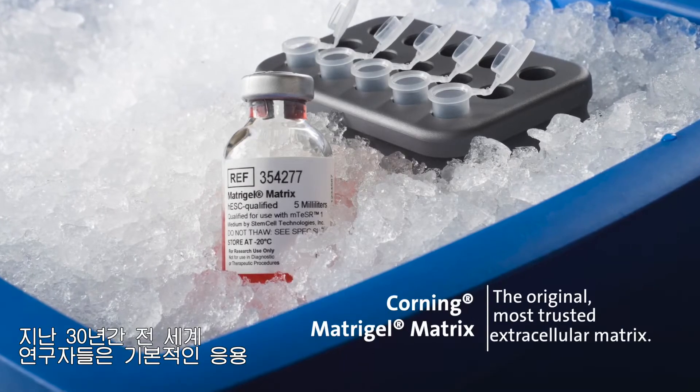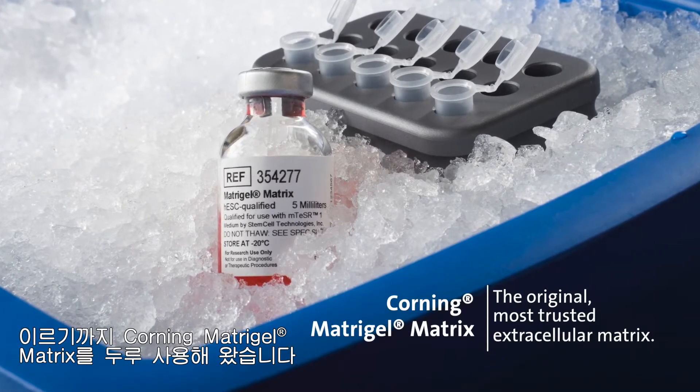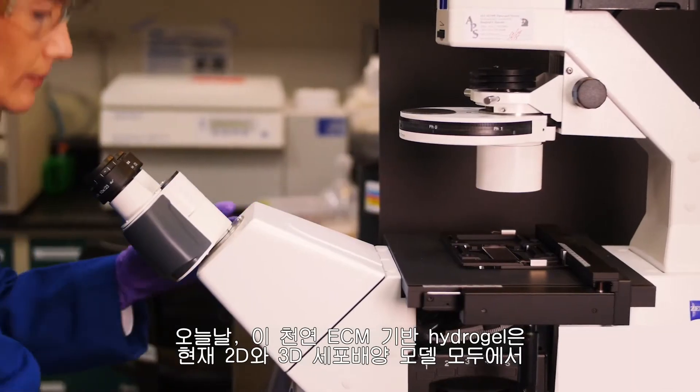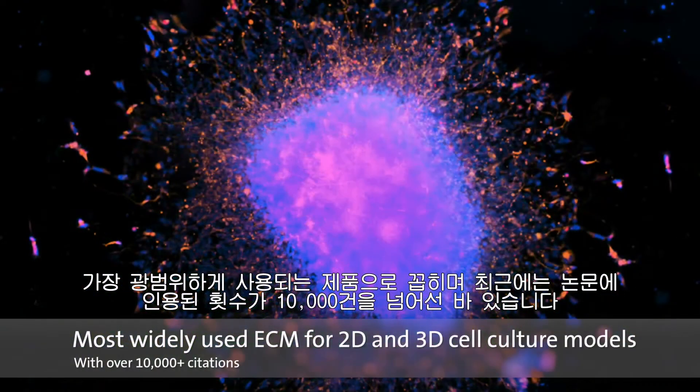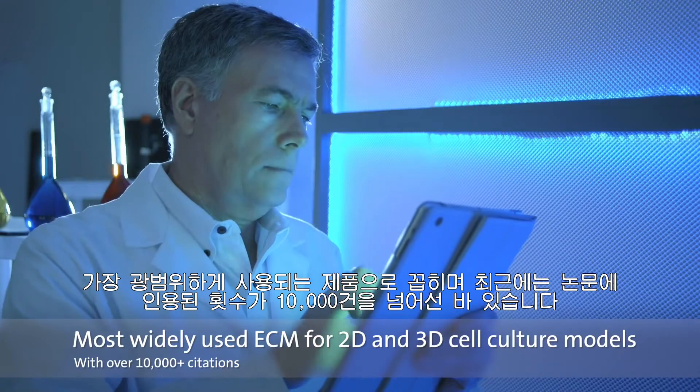For the past 30 years, Corning Matrigel Matrix has been used by researchers across the globe in essential applications through cutting-edge, life-changing research. Today, this natural ECM-based hydrogel is among the most widely used in both 2D and 3D cell culture models, and recently climbed over the 10,000 citations mark.